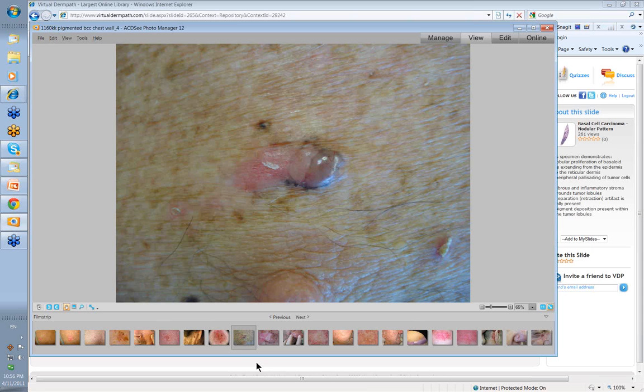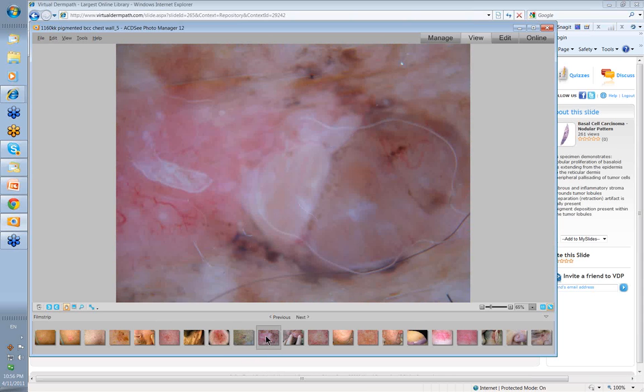And if we look at the clinical, that's clinical. If we look at the dermatoscopy, again, these are the serpentine vessels. These are the blue and some brown clods, and this was this, which looked like solid to cystic component. Again, the vessels here, again, some other clods. So, what other examples can we show you that we have?